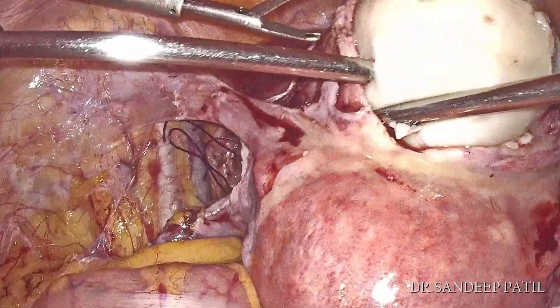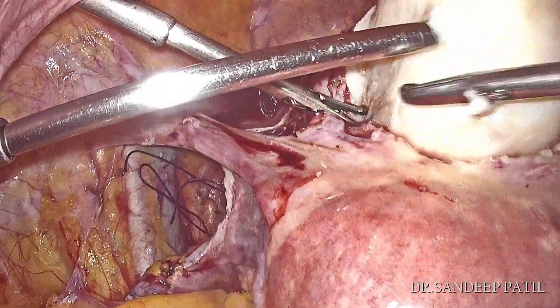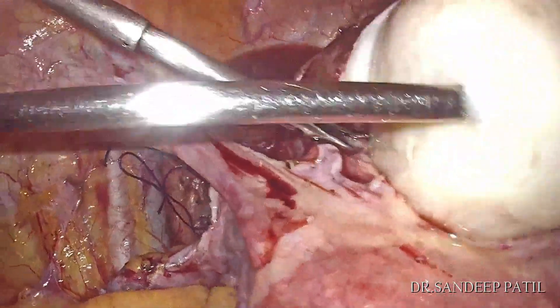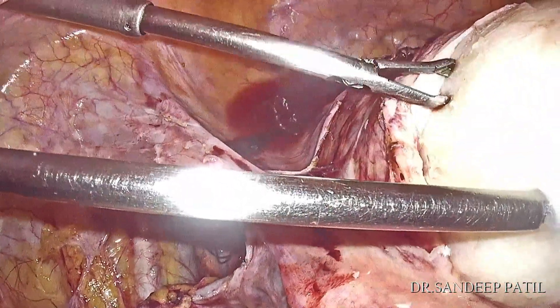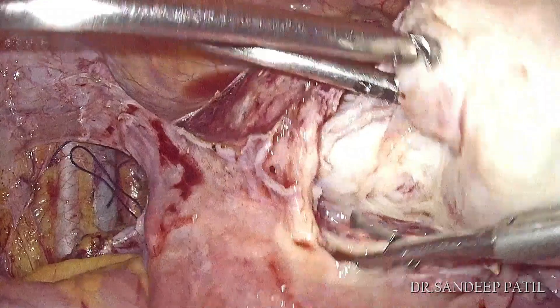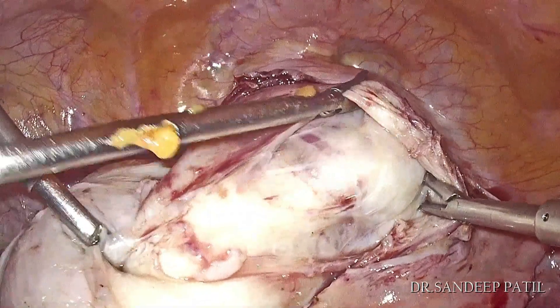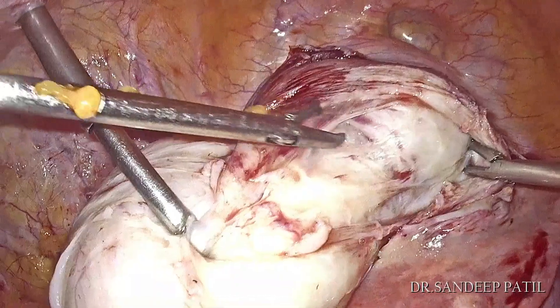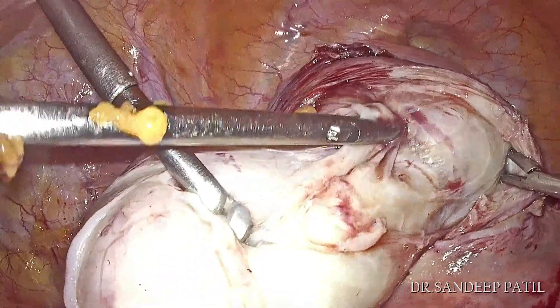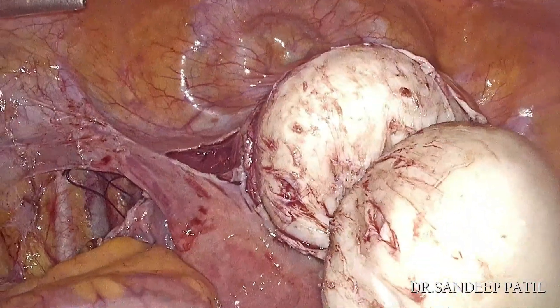After an adequate incision, myomas are being enucleated by sharp and blunt dissection. You can see the use of the myoma spiral at multiple sites facilitated this procedure quite well. As a rule, we avoid use of any energy source for this enucleation.